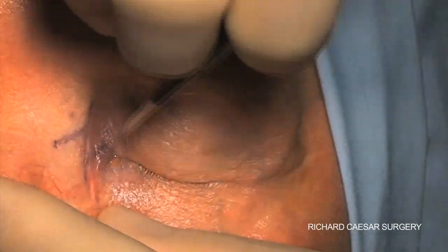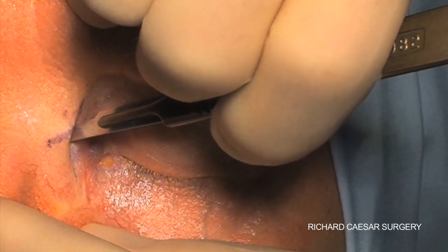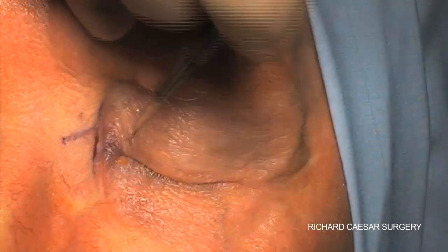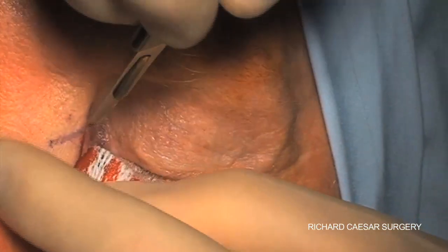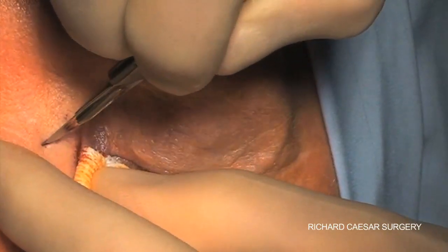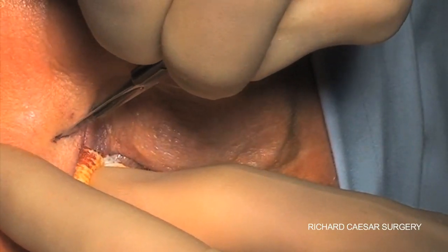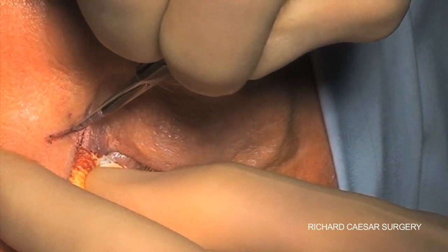The initial incisions are made through the skin, and you just need to be careful to keep the blade perpendicular and follow the lines that you've already chosen. Sometimes when cleaning the skin your marks can be rubbed off, and if they're a little faint the best thing is simply to draw them on again.